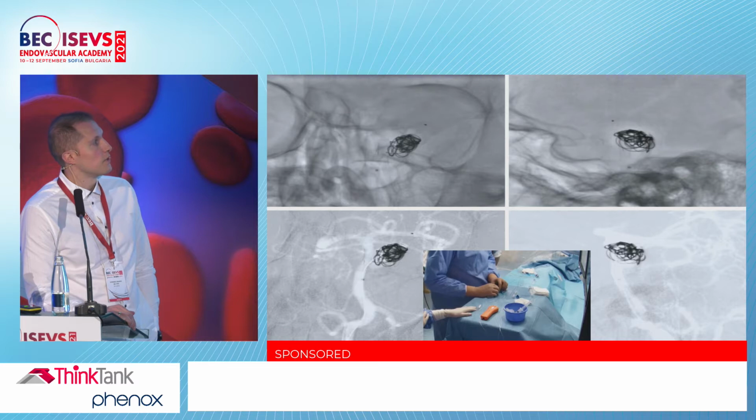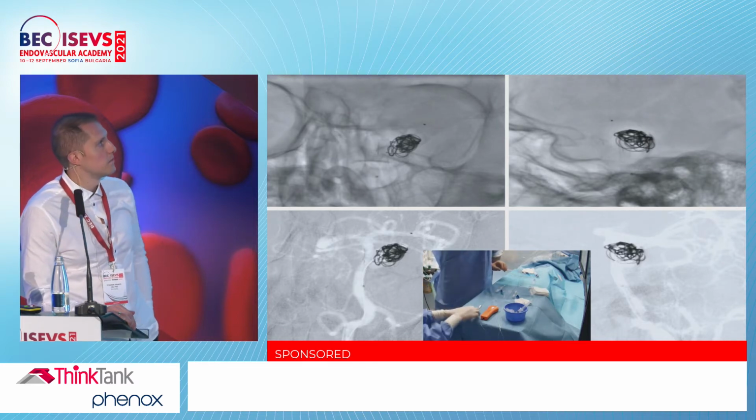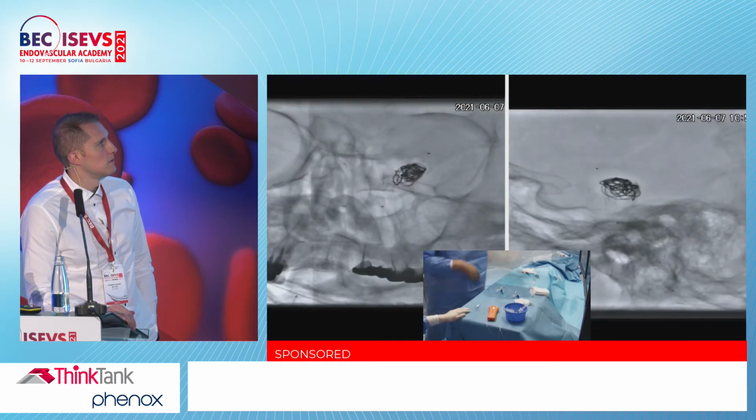And then look, you can see it above. It's perfectly applied, covering the neck of the aneurysm. So we're going to do a final run to see that everything is in place and at the desired positions.